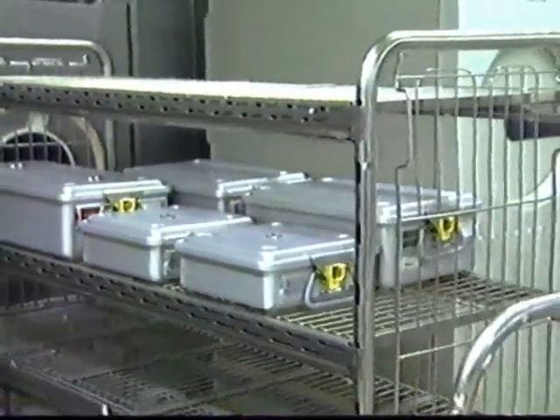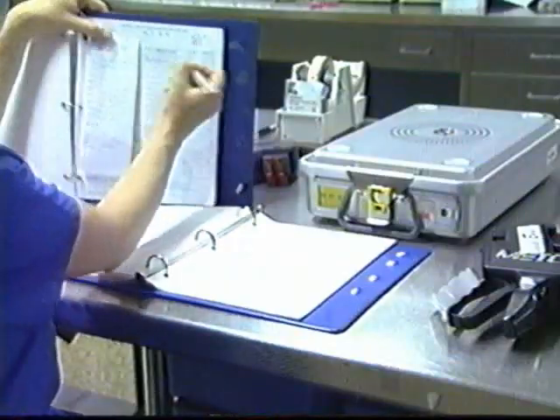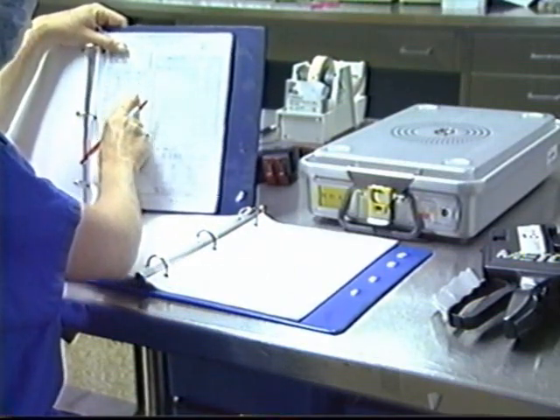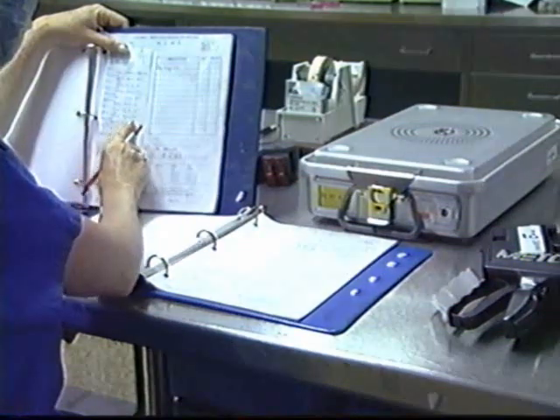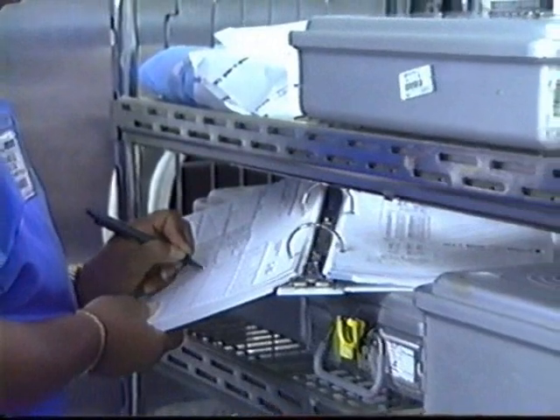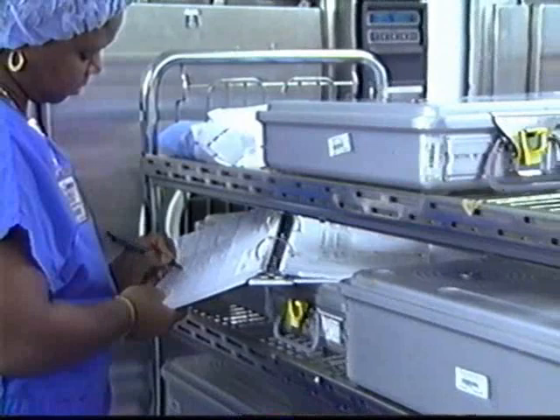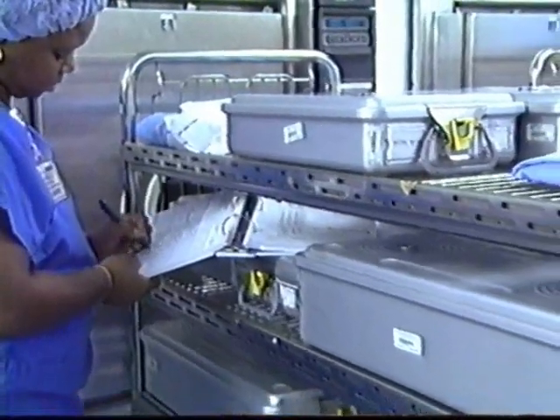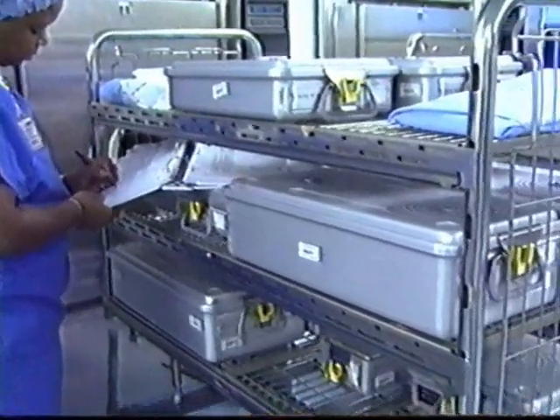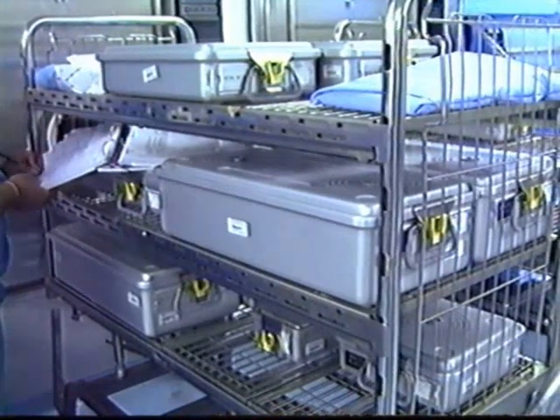Consult the recommendations of your sterilizer manufacturer in order to determine the correct parameters regarding temperature, weight load, dry time, instrument processing, and pre- and post-conditioning cycles. Use of the Stereotype container in gravity displacement steam may increase exposure time. Following the sterilization process, the cart should be removed from the sterilizer and placed in cool-down for a minimum of 20 minutes to minimize the potential of condensate formation within the container.